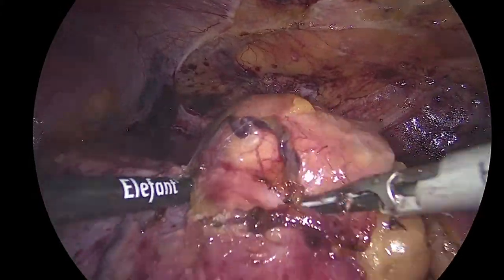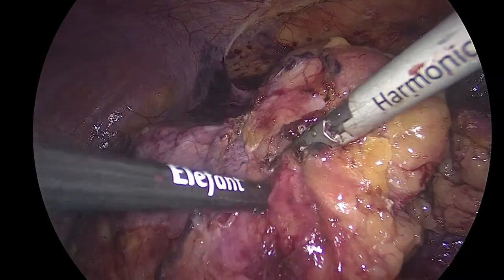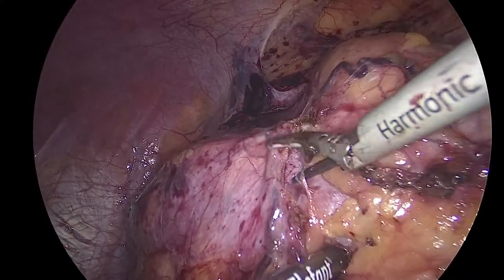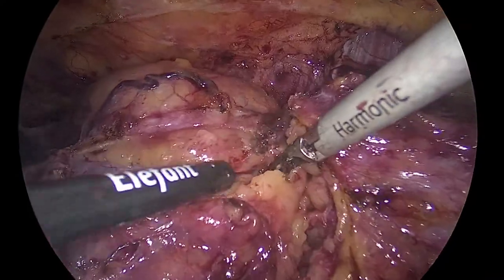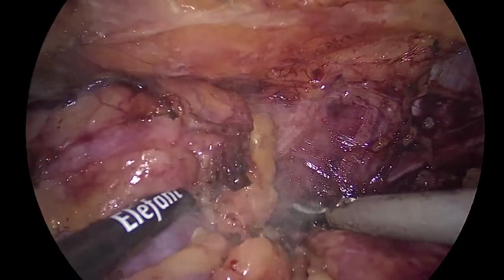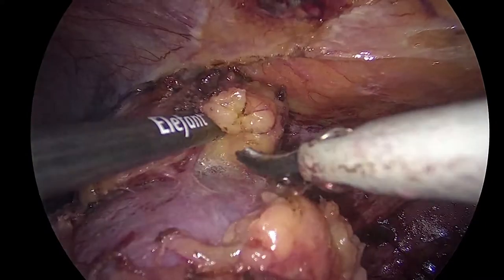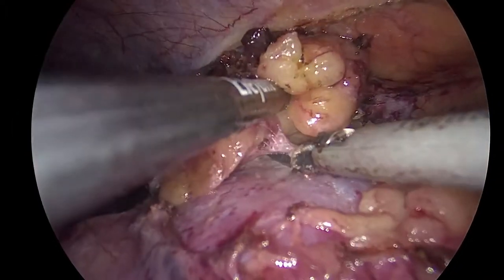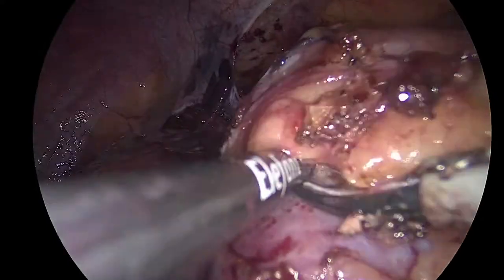I think this looks like the tumor here. I don't know where it starts from. So I will go here and try to find my way. Come closer. Good. I'm swimming to the right. Good. Come here. It's not the tumor there. Maybe the tumor is more anterior. This is the tumor here. Come to the left. Good.